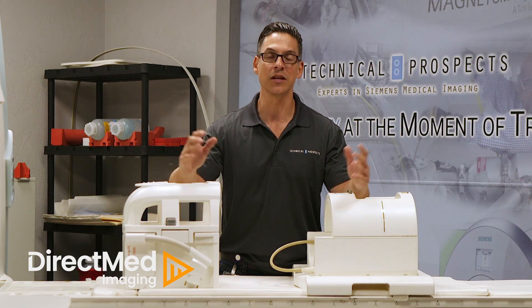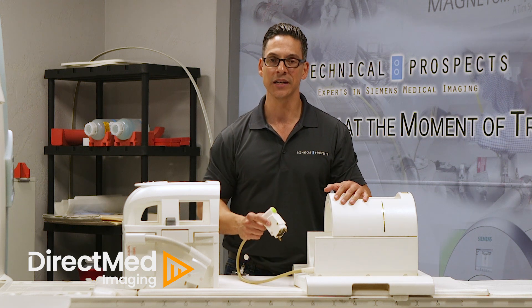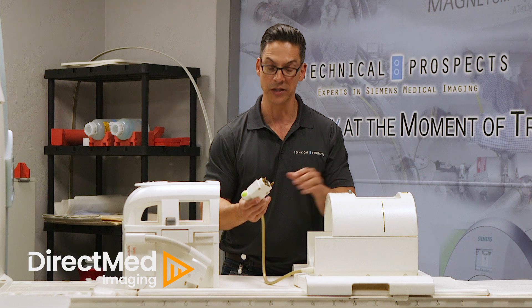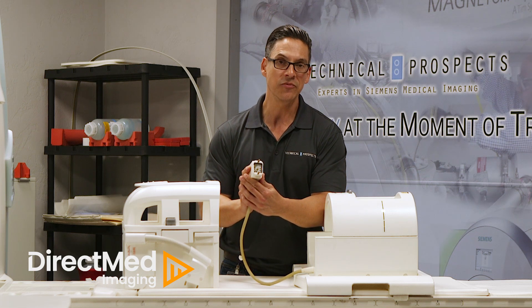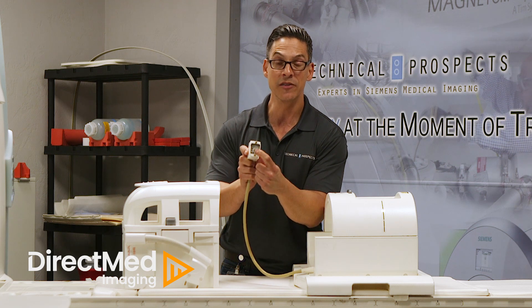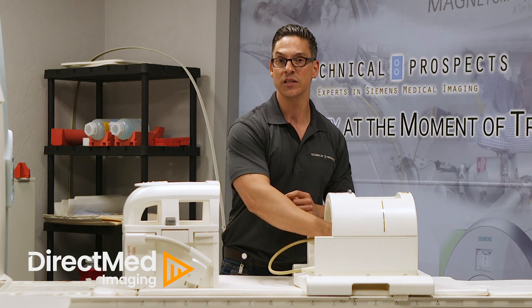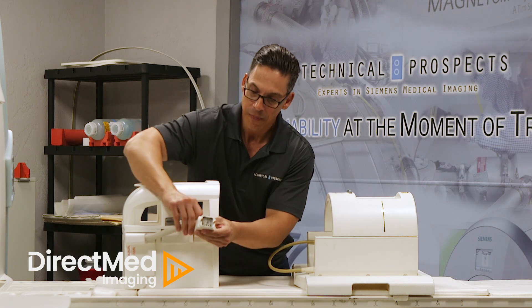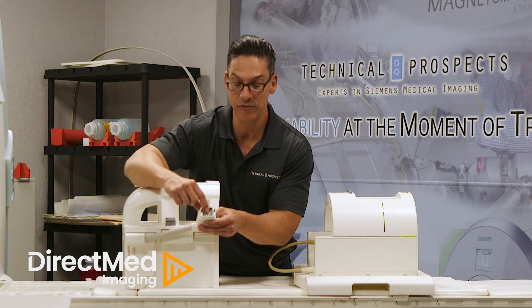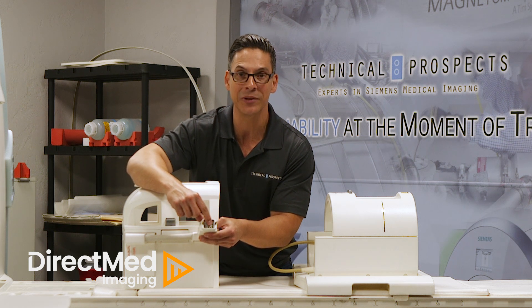Check this out — it's all in the plug. This is a knee coil, and it is a transmit-receive coil. The way you can test it real quick is by just looking at the plug. The transmit-receive coil will have a copper plug in the middle of this entire plug, versus a receive-only coil, which does not have a copper plug in the middle. It is basically just a fill-in plastic piece.